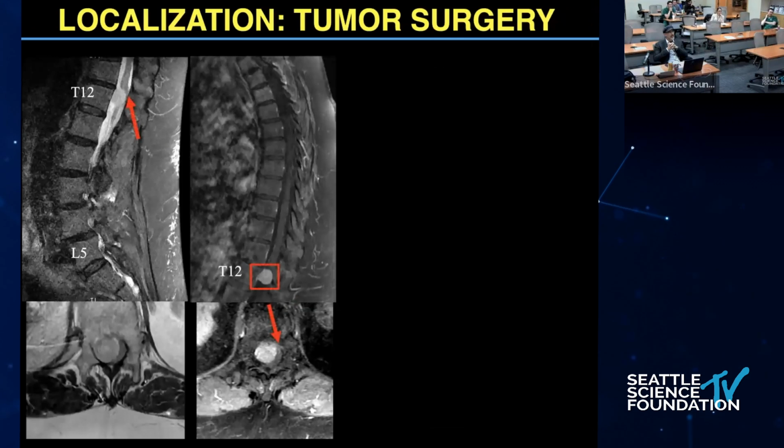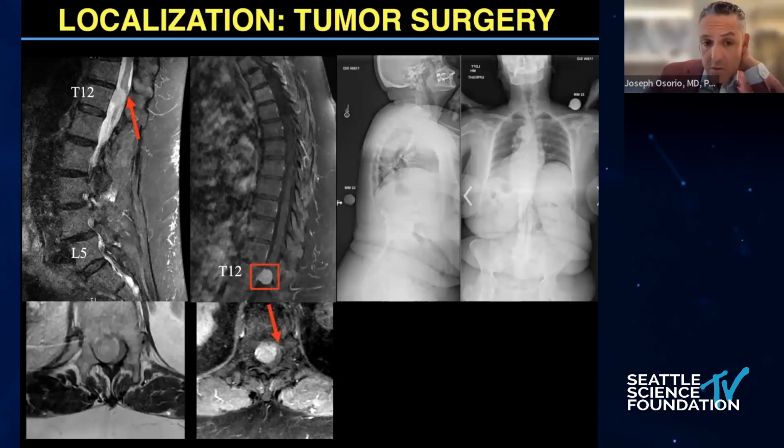Every now and then when you do tumor surgery, you will encounter cases that you might not have done electively. I have a strict BMI cutoff of 35 for my elective practice, but this is a patient that came in profoundly myelopathic with an intradural meningioma. When you're doing a high BMI case like this, you want to make sure you localize the level well. Oftentimes for tumor surgery in the past, I would have the radiologist place a fiducial screw pre-surgery day so that I can go down and find the fiducial screw if it's in a region where localization may be a challenge.